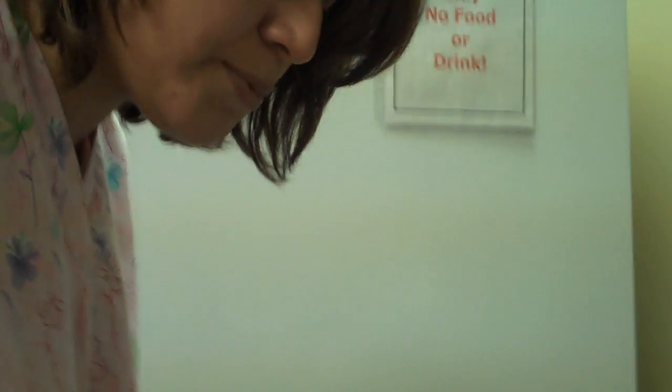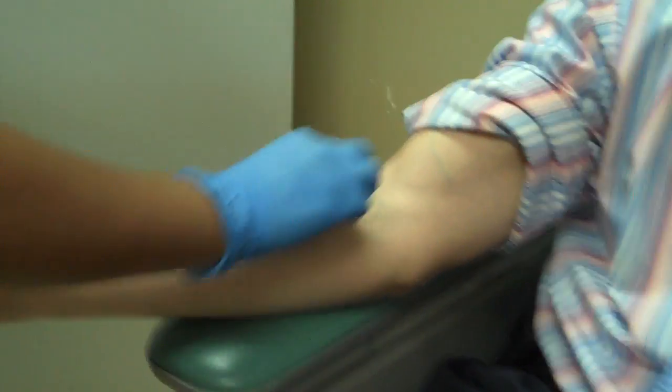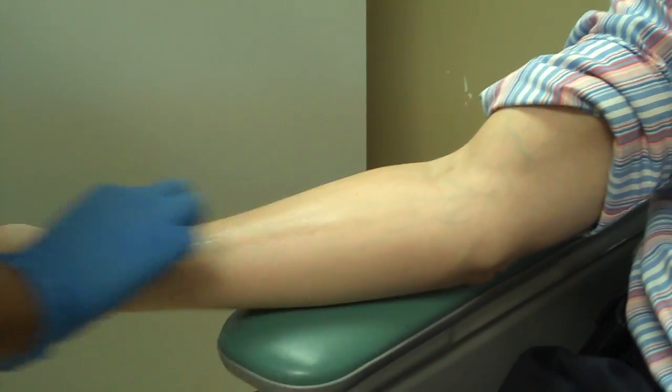My name is Vanessa and this morning we're testing Dr. Coffman. The first step to allergy testing is going to be to prep Dr. Coffman's arms, and here I am with an alcohol wipe, just wiping the arms.